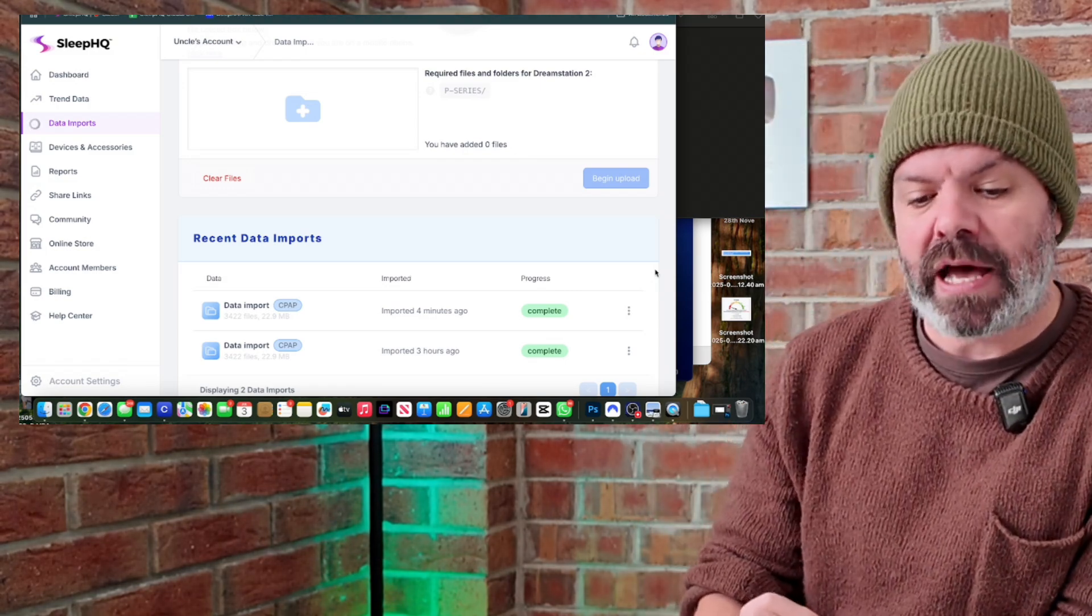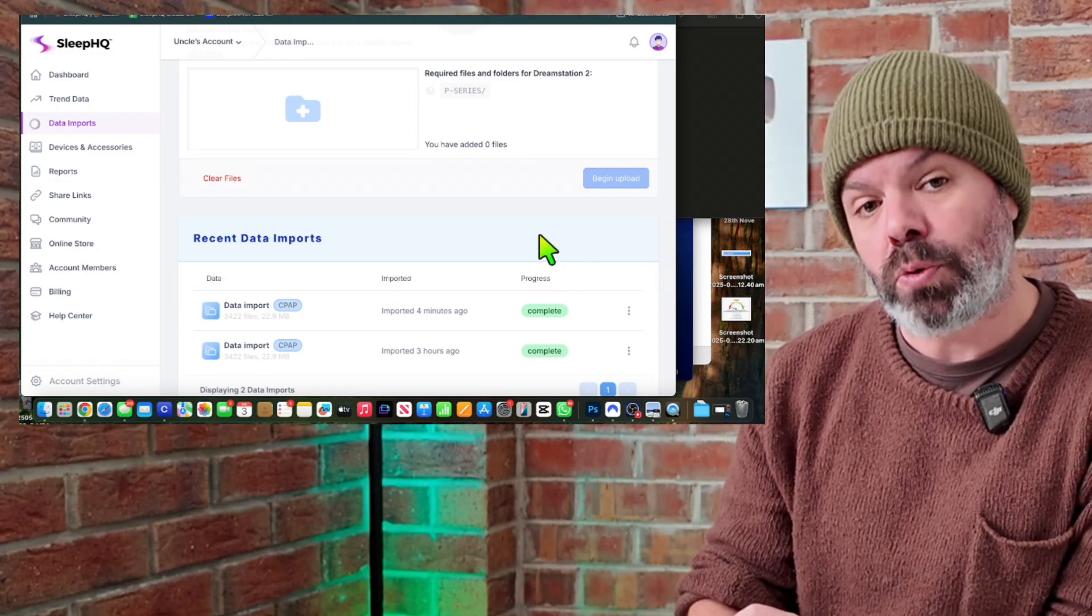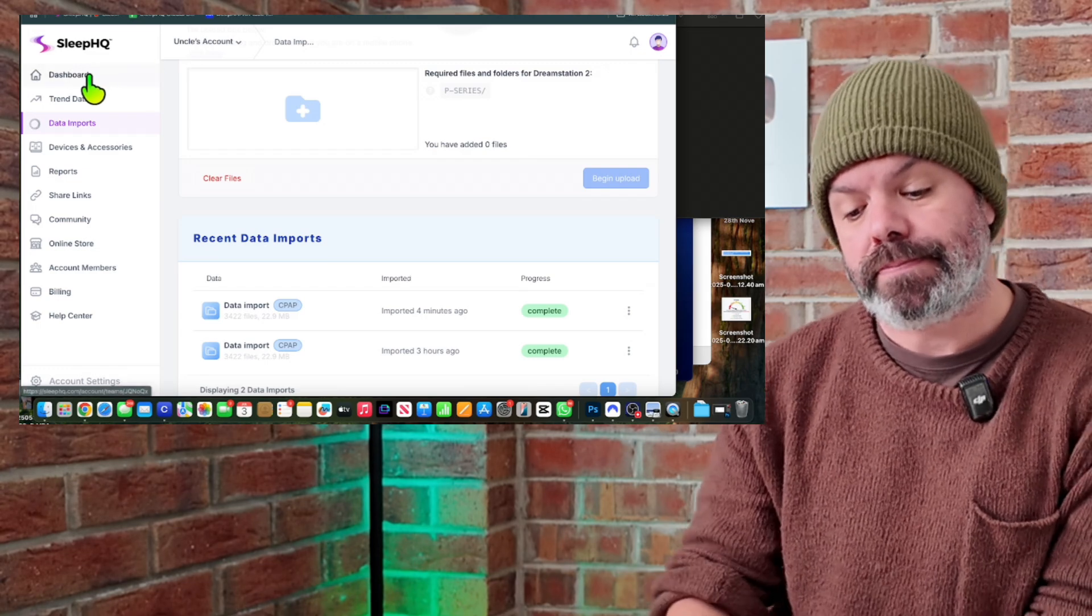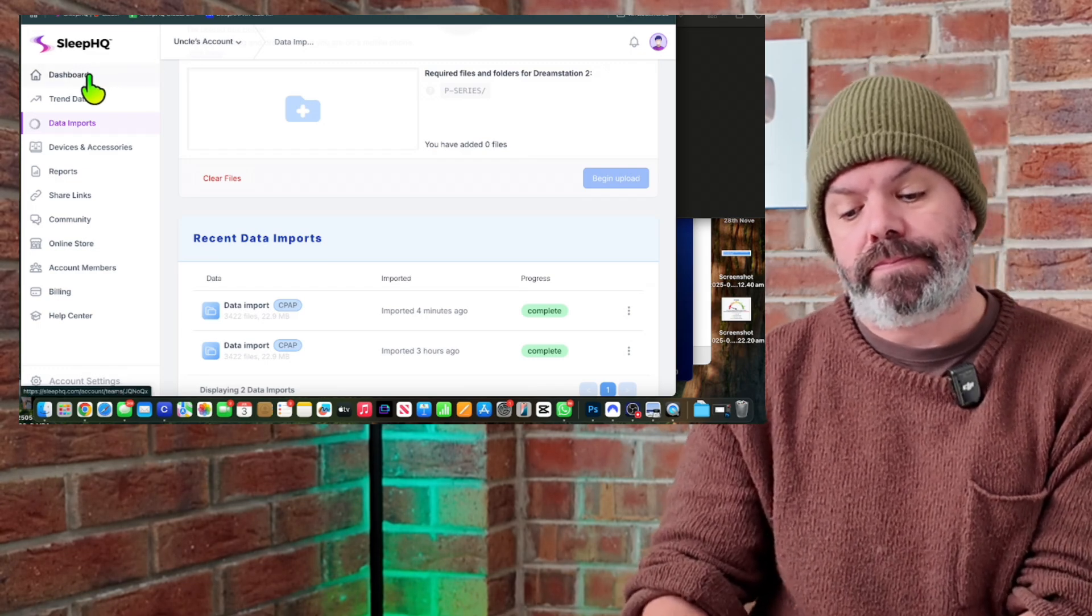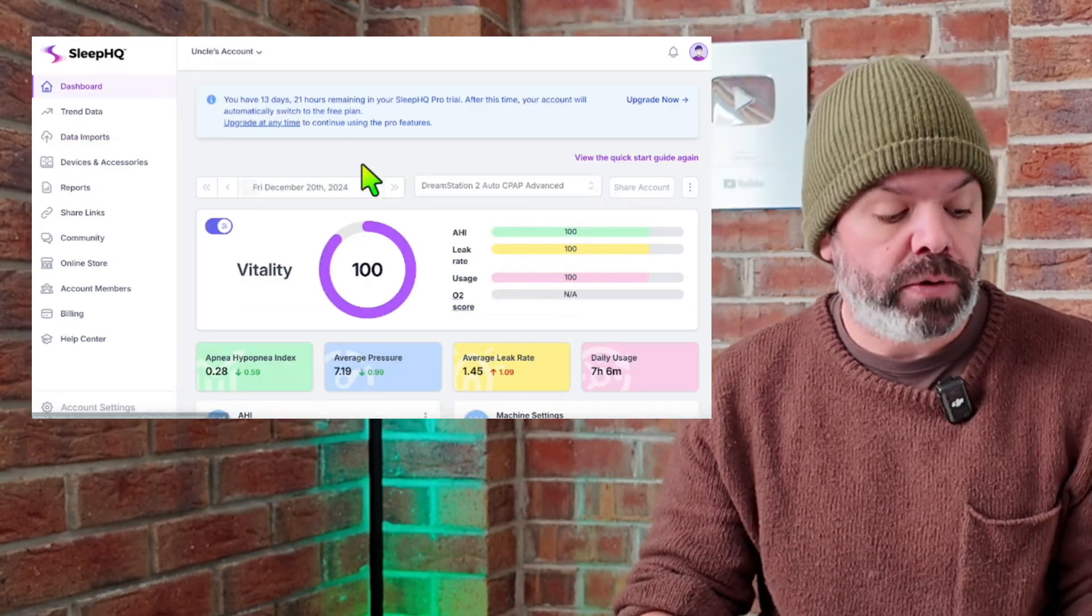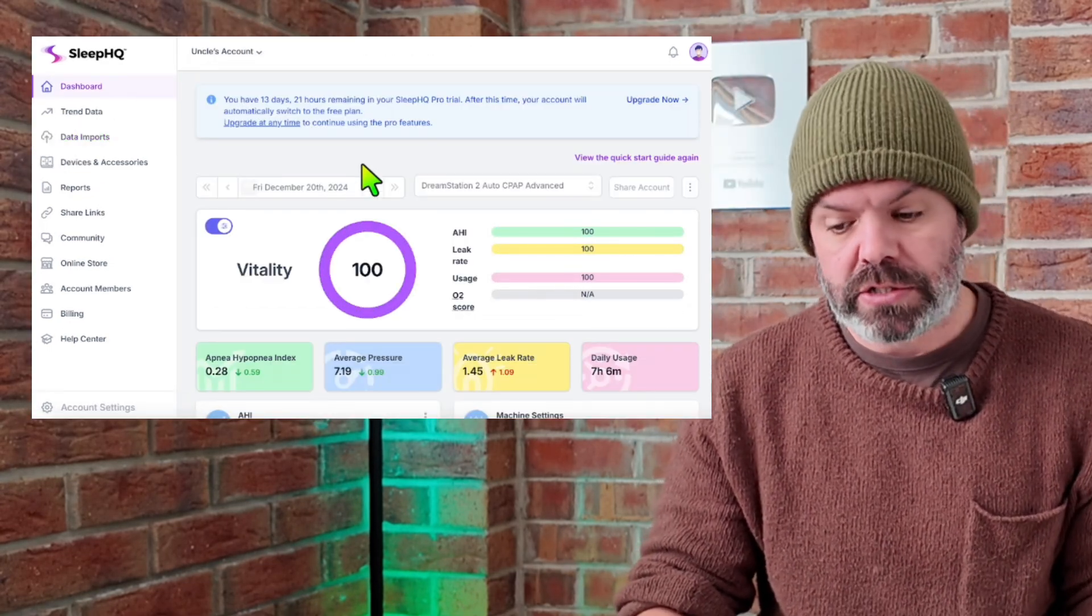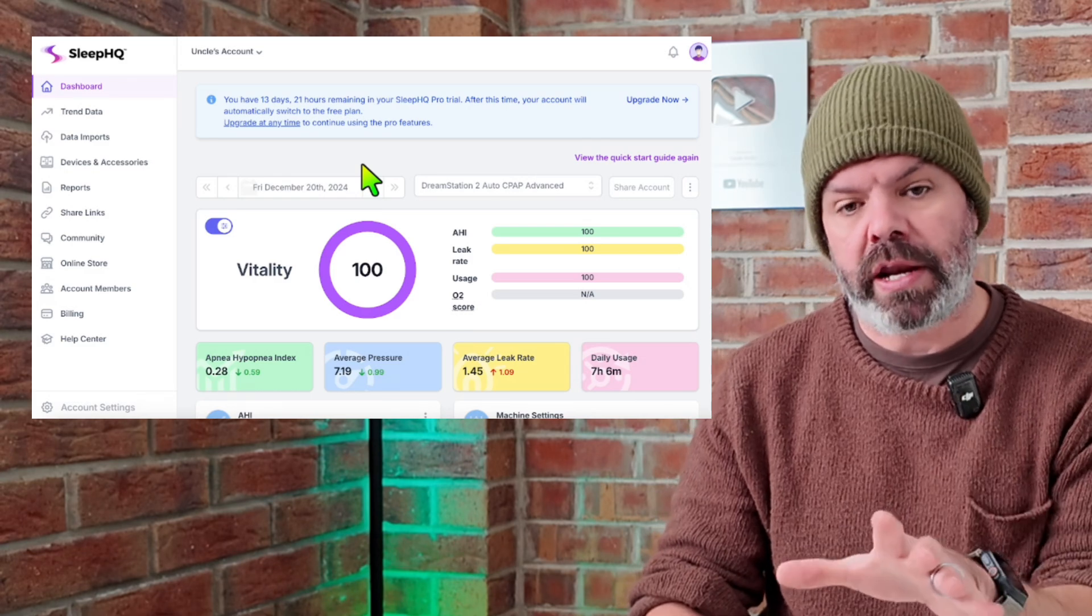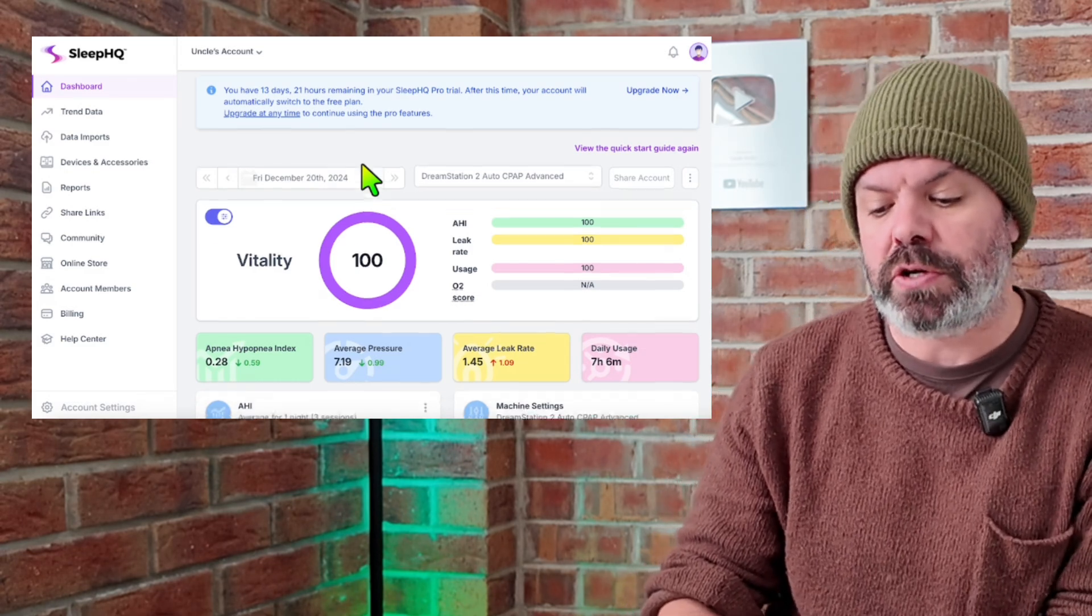Once you've done the upload, come up here to dashboard and then you have all your detailed DreamStation 2 data right here on Sleep HQ.